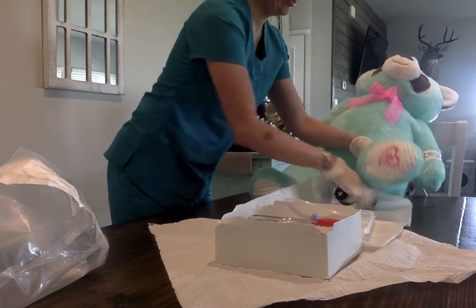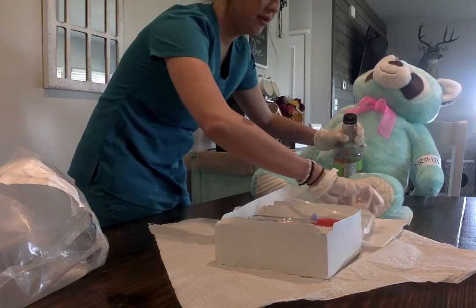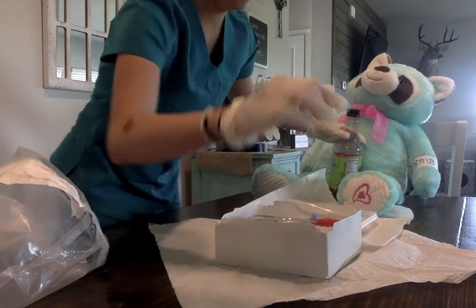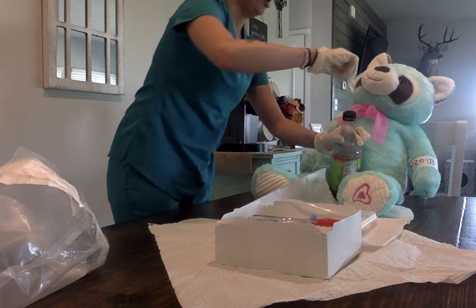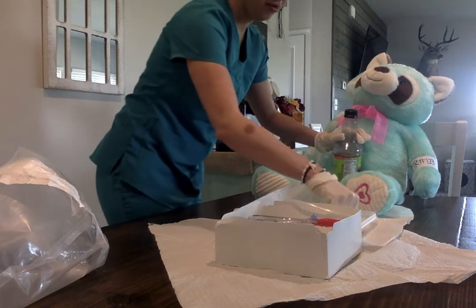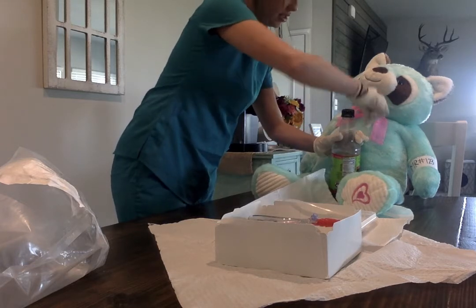Just hold this up at a 90-degree angle. And I'm going to clean. There we go. Breaking the sterile field. I'm going to take one cotton swab and go down to the base. Clean and throw that away. And I'm going to repeat that 2 more times, starting from the top all the way down to the bottom.